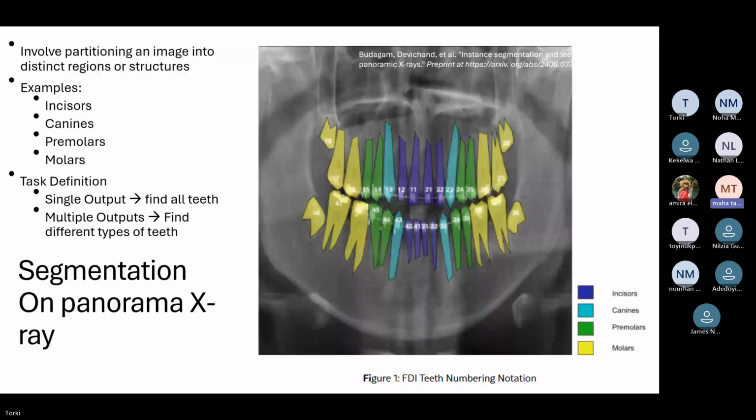Okay. So I think for many dentists, the exact resolution level like 500 by 500 or so may not be known. But maybe this is like a general question about the quality of the radiographs. Let me give you a sense: at 500 by 500, the image is less than 1 megabyte on the hard disk, which is very, very compressed. Usually you have one image coming from your mobile phone as 14 megabytes, and this mobile is 14 megapixels, so you can get the sense. Yes, yes. Thank you.